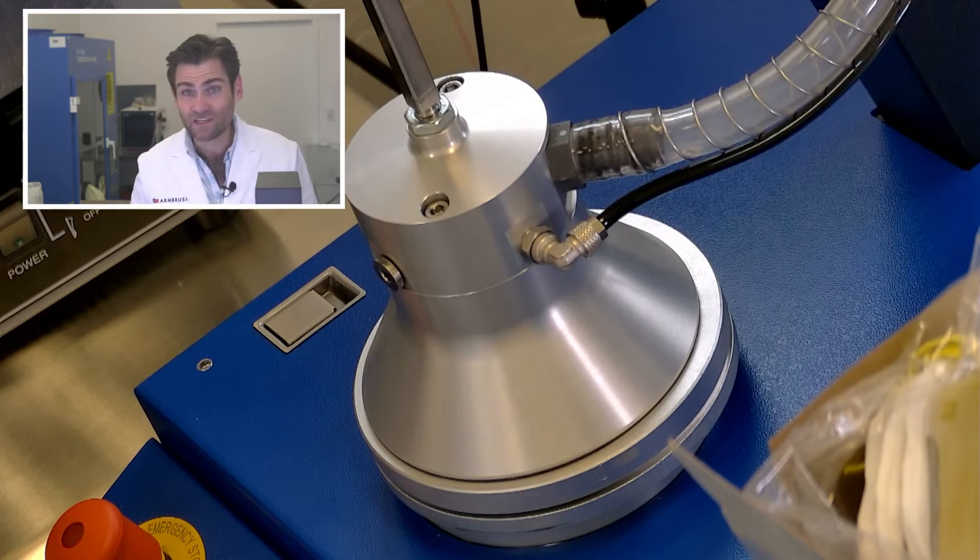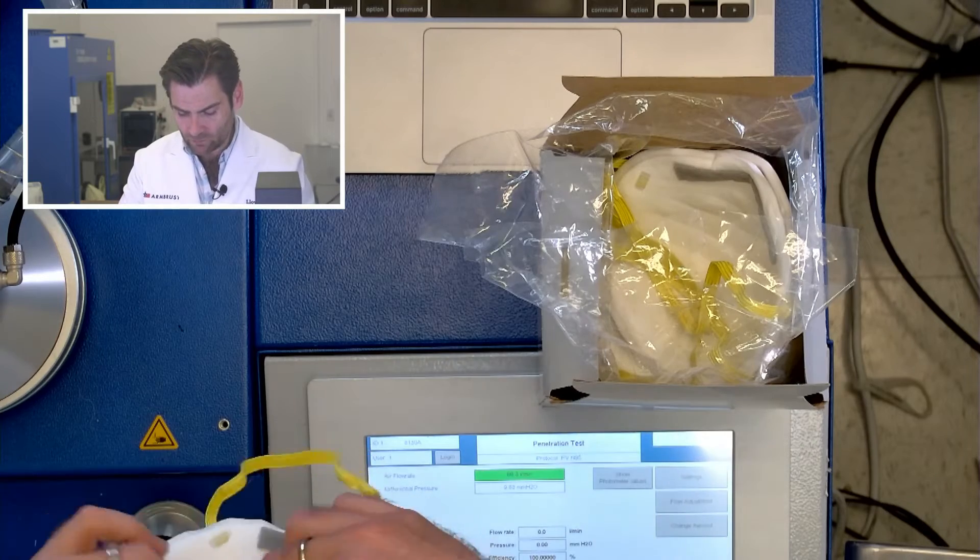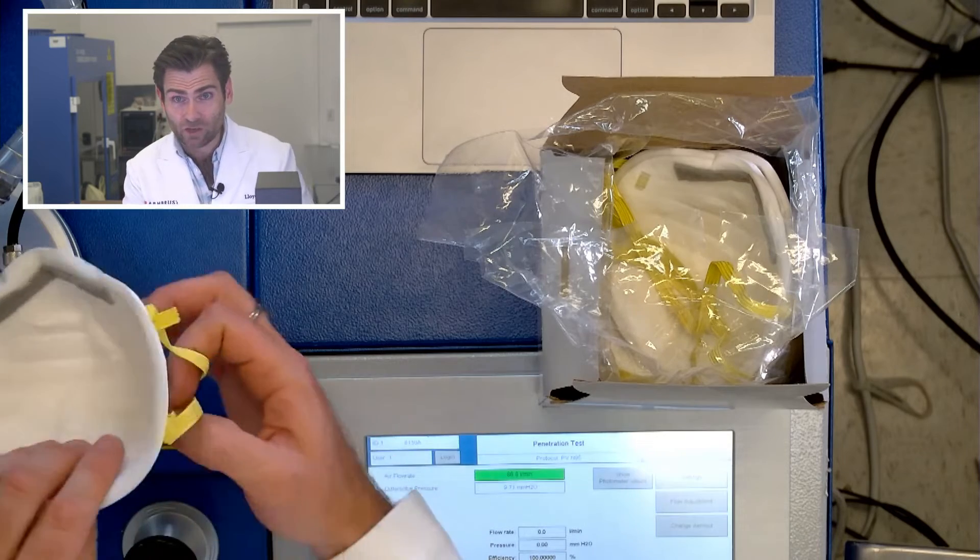This is the PFE machine — the particulate filtration efficiency machine. We have the 3M Performance Respirator 8210 Plus in the clamp. We're doing the N95 test, which is appropriate because this is an N95. We have a minute, so I'll show you how to properly don one of these.